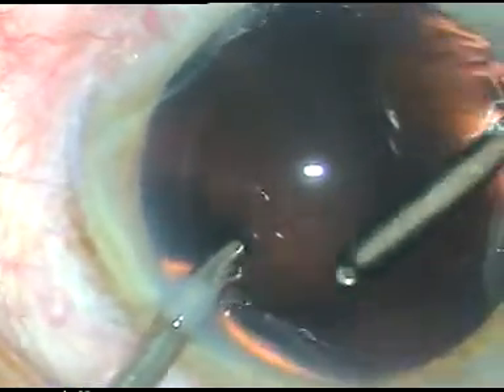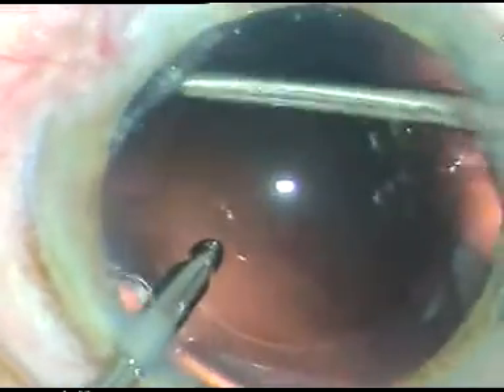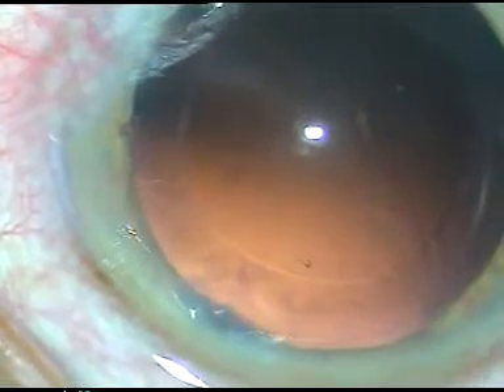Now I have to polish the posterior capsule as much as possible. We must be very careful in polishing the posterior capsule because this is a time when polishing may cause a PC rent. Though if a PC rent occurs at this time, it is actually the safest time. You can convert the PC rent into a posterior capsulorhexis and implant an IOL in the capsular bag.